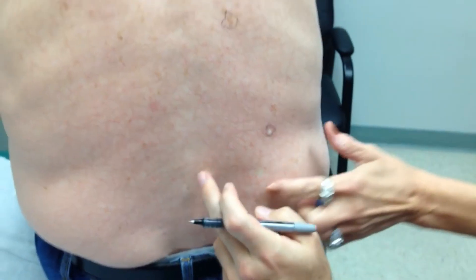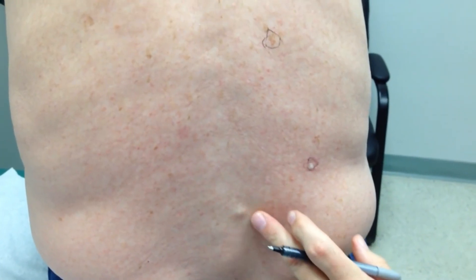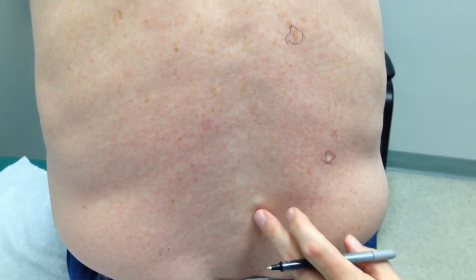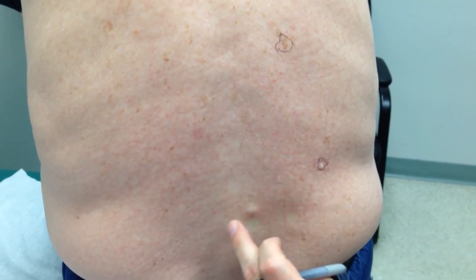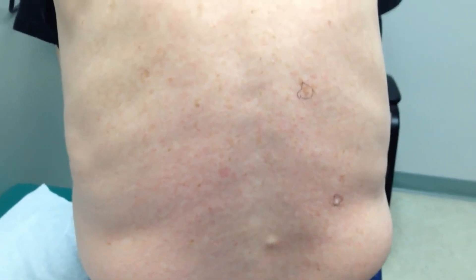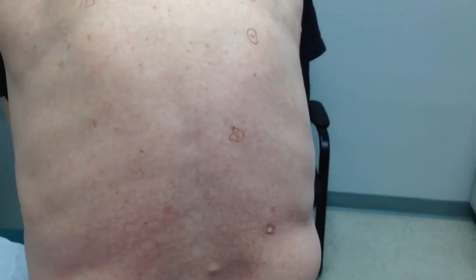Does that drain sometimes? Yes — that is a sebaceous cyst and we're going to leave that alone for now because it's kind of small. That's just a plugged oil gland. In time it can get larger, and if it spontaneously drains it's usually not a problem. All these others we're going to go ahead and freeze with the liquid nitrogen.